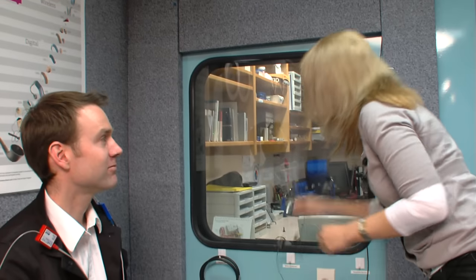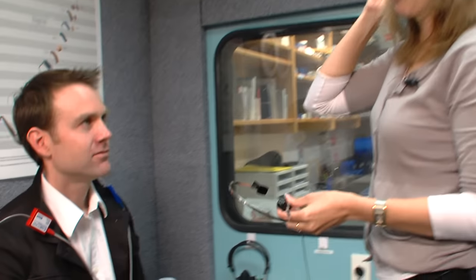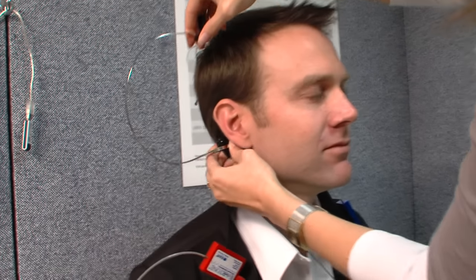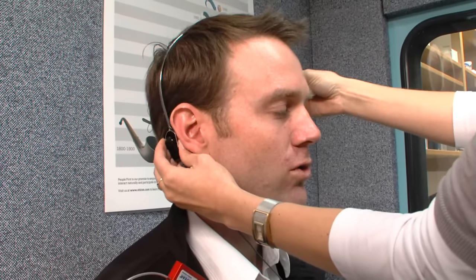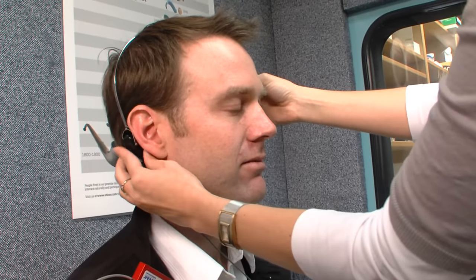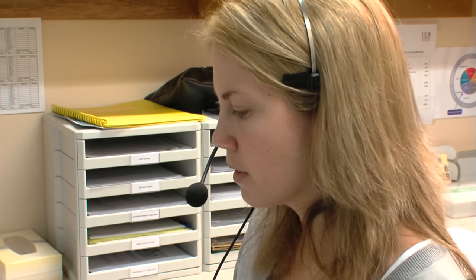Alright, you're doing well so far. What we're going to do this time is put this headband on and this little box just sits on the bone behind your ear. So all you need to keep doing is exactly what you have been doing — just pressing that button whenever you hear the beep. This time you could hear it in either ear. In the case shown here, the site of lesion is found to be the cochlea itself, rather than the middle or outer ear.